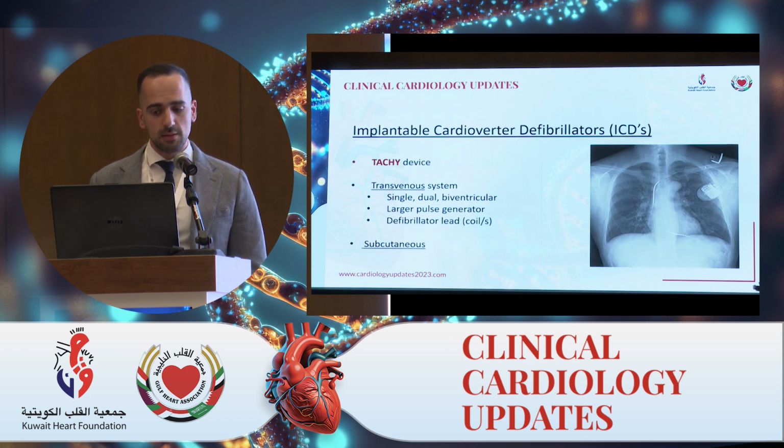An ICD is better thought of as a tachy device. These are devices we implant in patients to protect from life-threatening arrhythmias, namely VT or ventricular fibrillation. On an X-ray, as I said, the pulse generator will be a little bigger, but again, the defibrillator lead will have the high voltage coils, which you can see there are two of in this, and these are vectors that the device will use to defibrillate the heart.